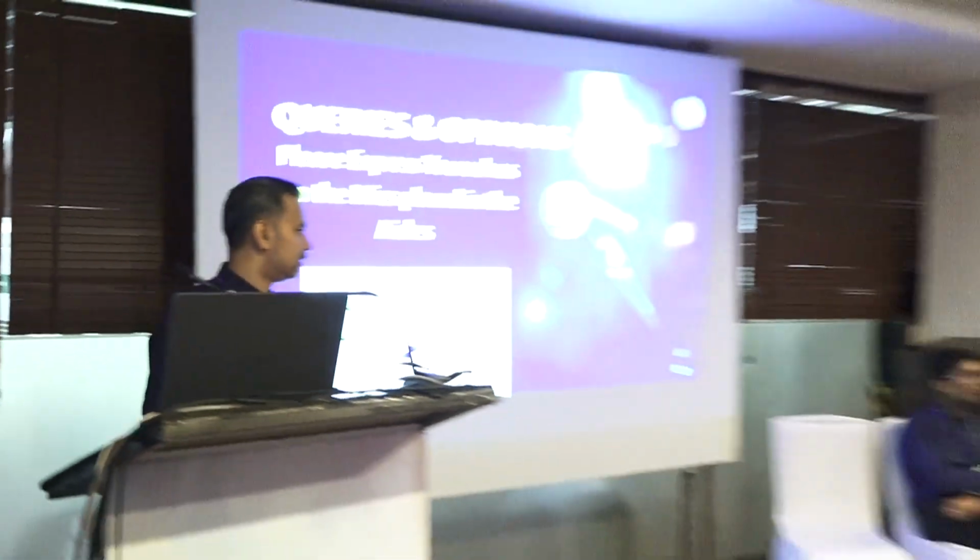Thank you, George, for that excellent talk, our Pachy man from India. George, I have just a few questions for you as Dr. Harshad is getting ready. One, is there any biomarker which points to the fact that this is a pachychoroid neovasculopathy? Two, do biomarkers help us decide which anti-VEGF is of choice, for example in the setting of PCV? And third, for peripapillary pachychoroid syndrome, what is the treatment of choice?